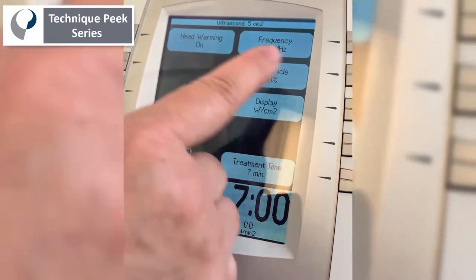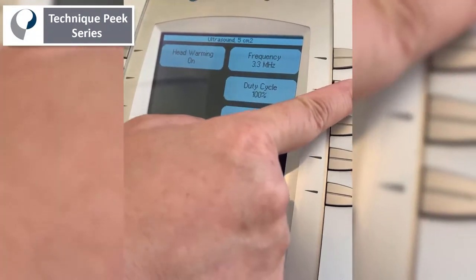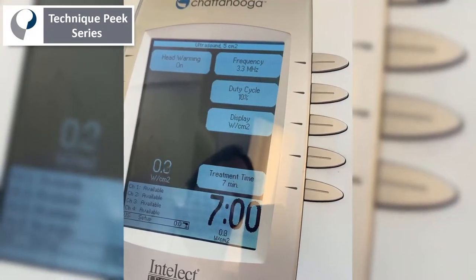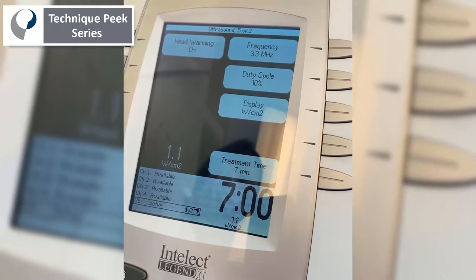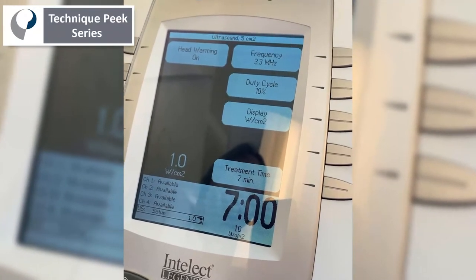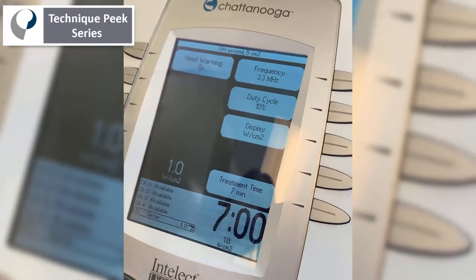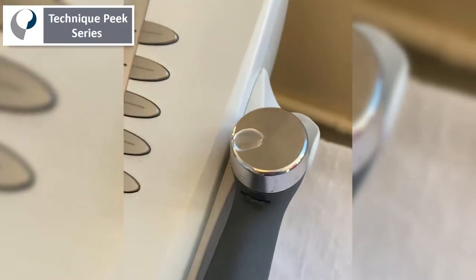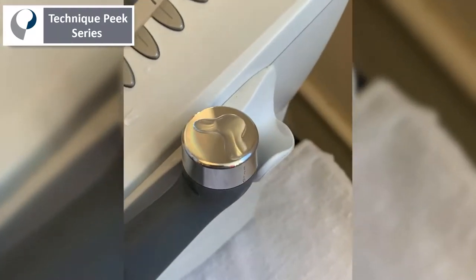This is at 3.3 megahertz for superficial ultrasound. Let's start at 10% for demonstration purposes for the ultrasound head. I need to set it up at a certain watts per centimeter squared intensity, but most importantly, you need a little bit of water to add to the ultrasound head. I usually use a paper towel to add some water there.